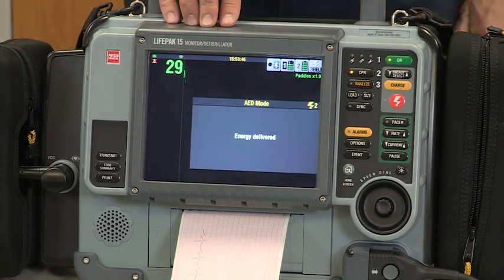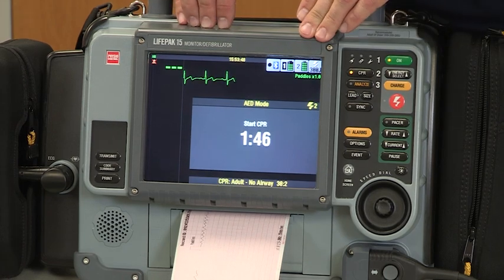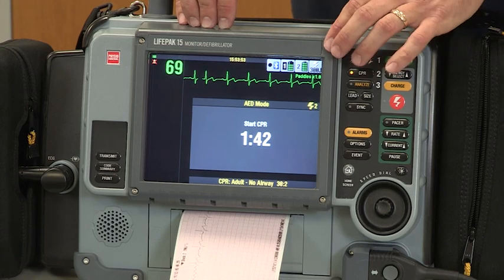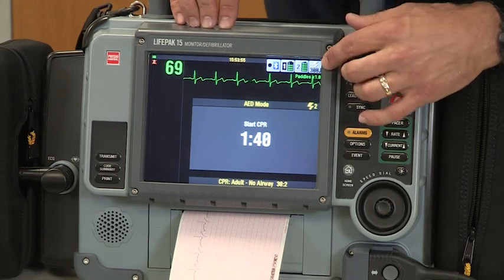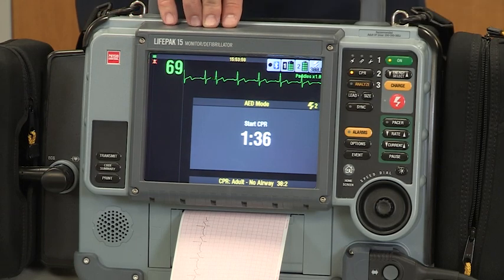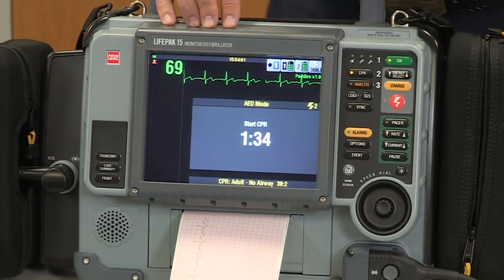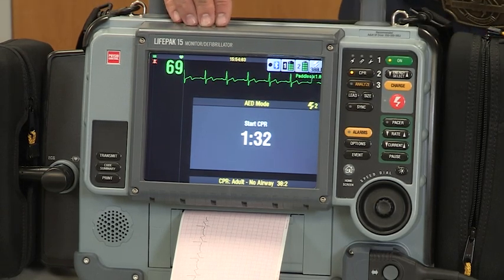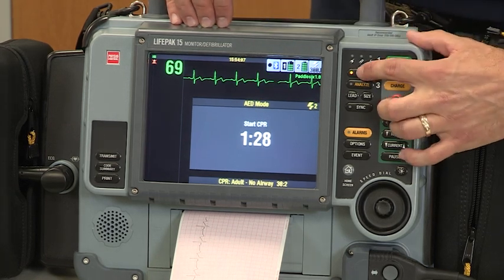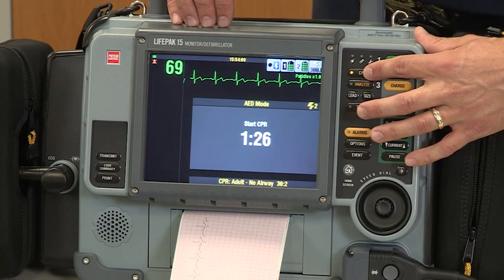So shock's been advised in the AED mode, go ahead and push the shock button. One of the things you'll notice when you go from the manual mode to the AED mode is it'll drop the joules back down to 200. Right now it shows 300 joules because we delivered one shock at 200. So it's going to start over at the AED protocol and work its way up, 200, 300, 360 in AED mode.